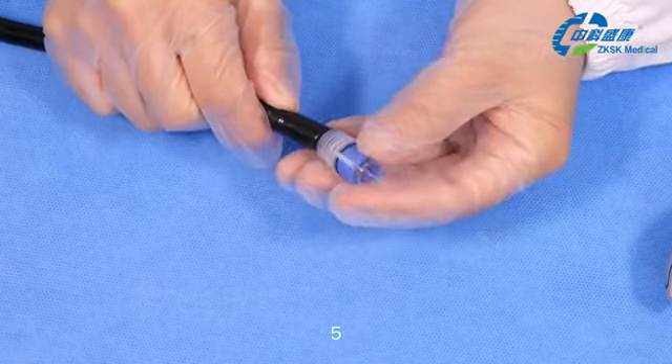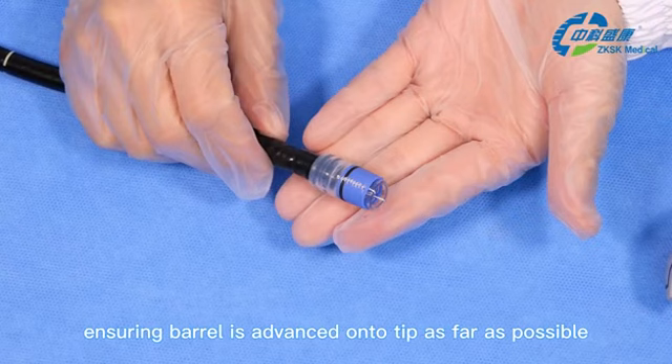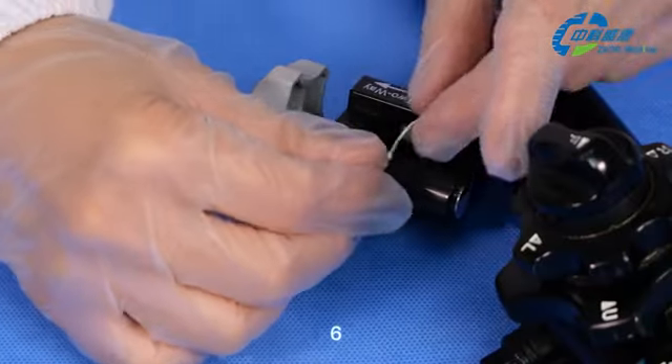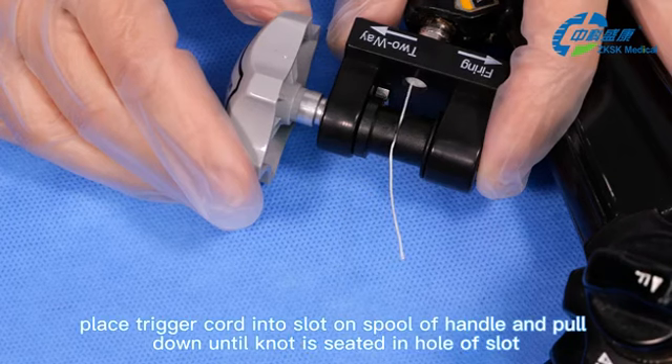Fifth, attach the barrel to the tip of the endoscope, ensuring the spring barrel is advanced onto the tip as far as possible. Sixth, with the endoscope tip straight, place the trigger cord into the slot on the spool of the handle and pull down until the knot is seated in the hole of the slot.